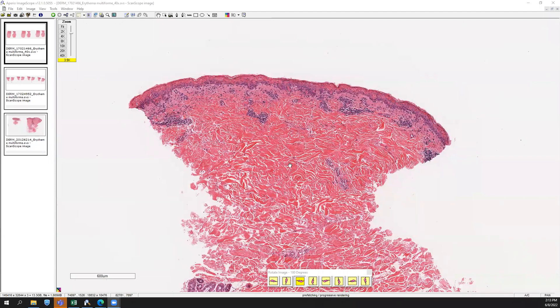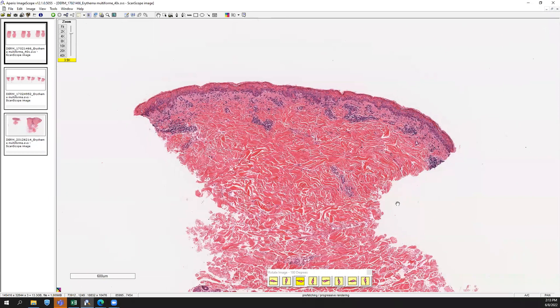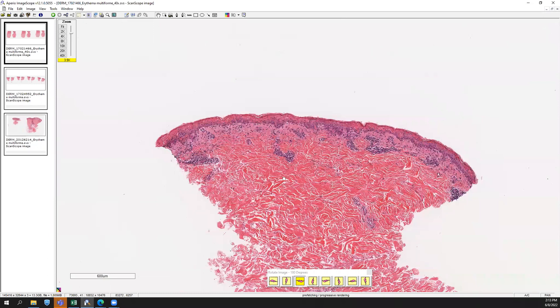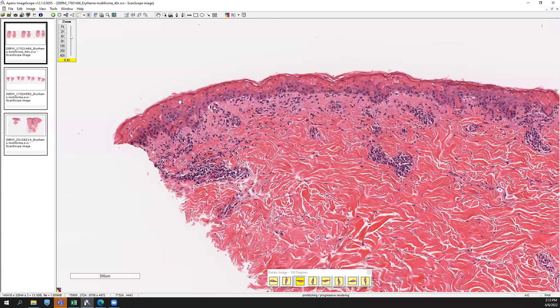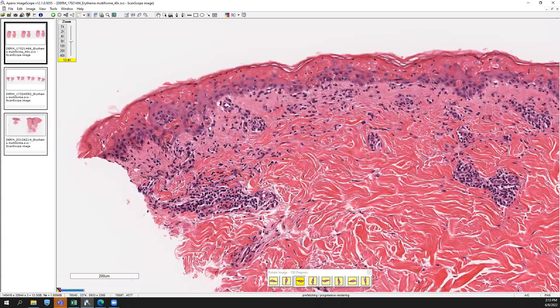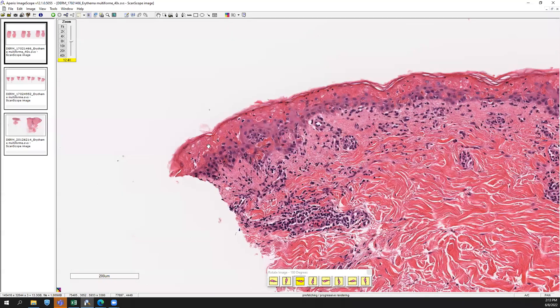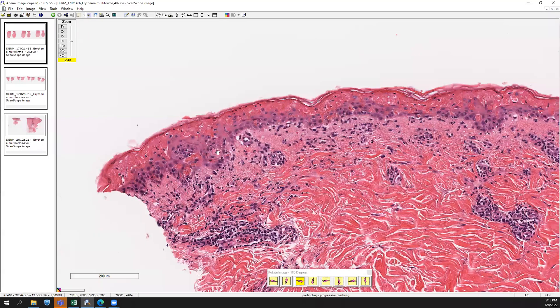We have a punch biopsy and you can see that the inflammation is limited mostly to the superficial dermal-epidermal junction area. On higher power you can appreciate this eosinophilic homogenous change happening in the epidermis, which is suggestive of dyskeratosis or necrosis. It actually extends down to some of the basal keratinocytes, but it's not homogeneously full thickness.